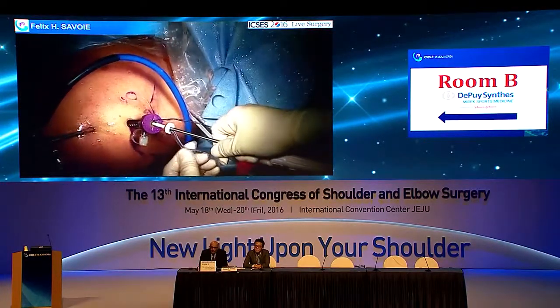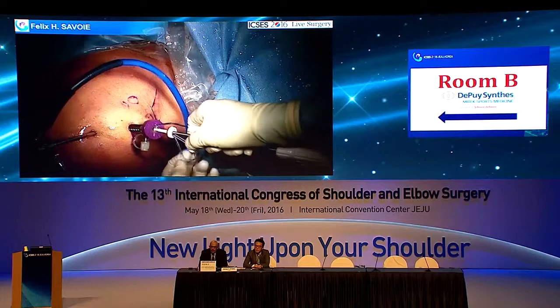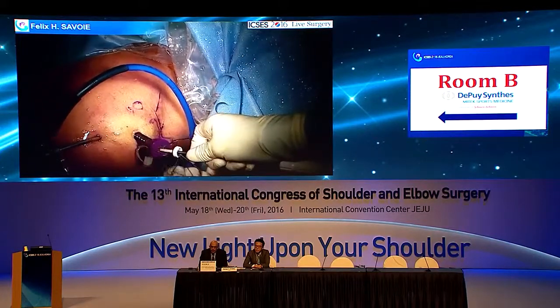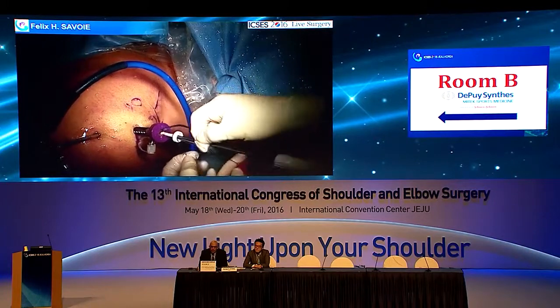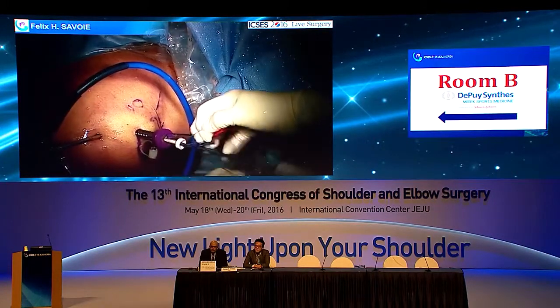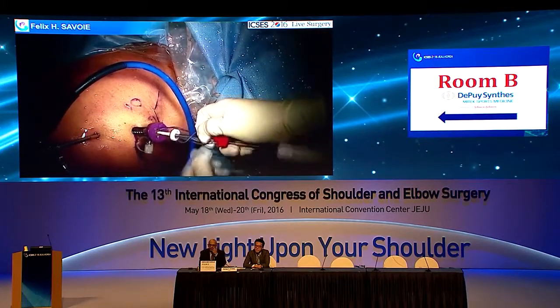So what's that little white disc there? So that's for cleating your stitches. I'll show you in just a minute.